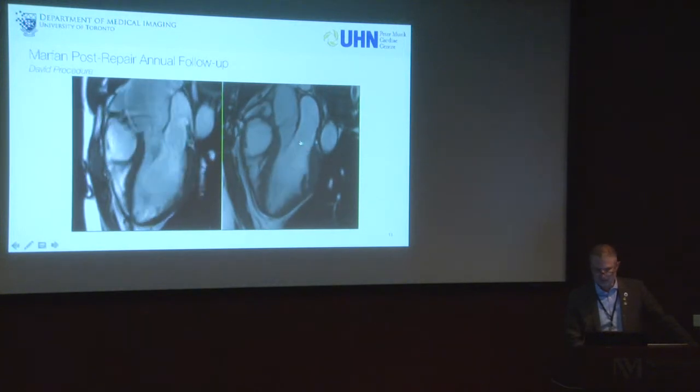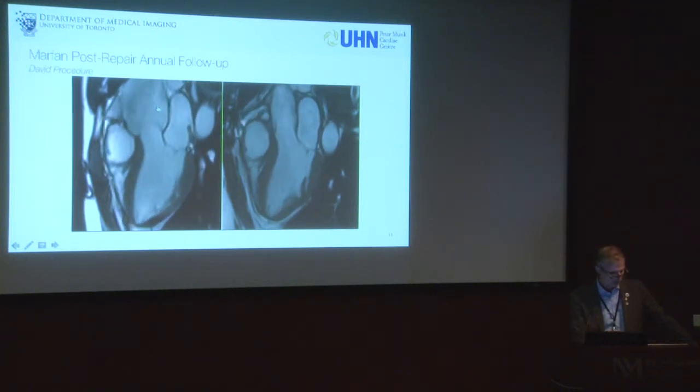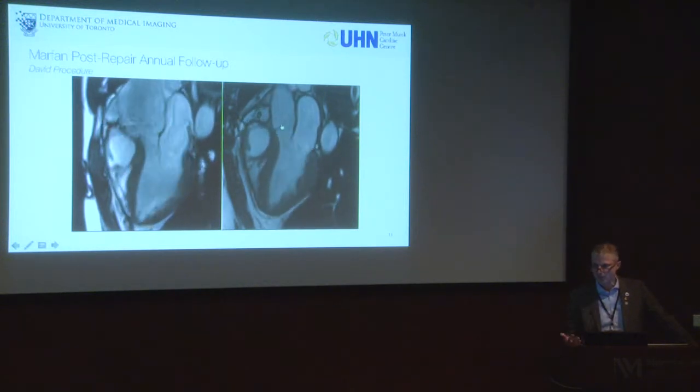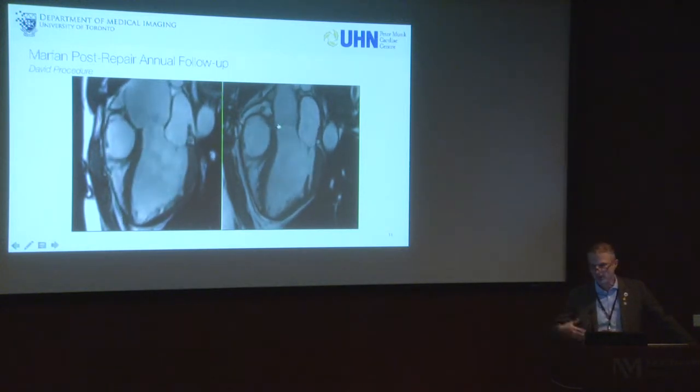And another case here, we are happy to have one of the world's most famous surgeons in our hospital, Tyrone David, who invented the David procedure. That's why we actually have a lot of Marfan patients coming up in our hospital. This is a young patient you see here prior to surgery and after David procedure here with a replacement, but the valve has not been removed. David procedure is a valve maintaining surgery where the ascending aorta is replaced, and those patients are coming up because they have certain diseases like Marfan's for annual follow-up.